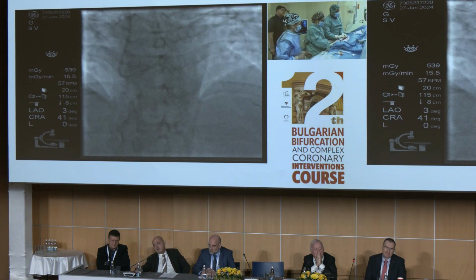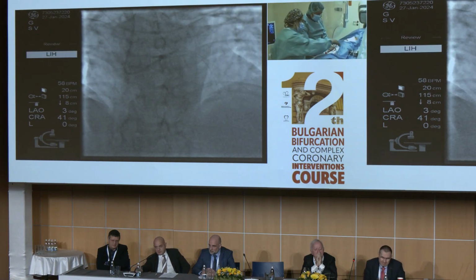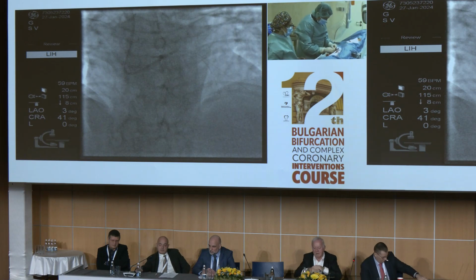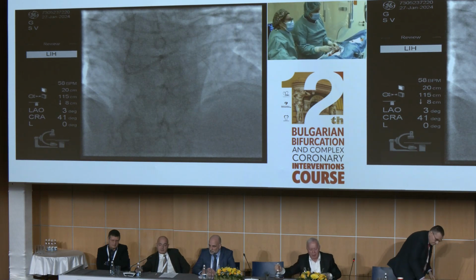So now we are totally safe. We didn't lose much time in this maneuver. It's a pity because the wire got entangled in the balloon, and we could not help losing it from the safety position. But okay.